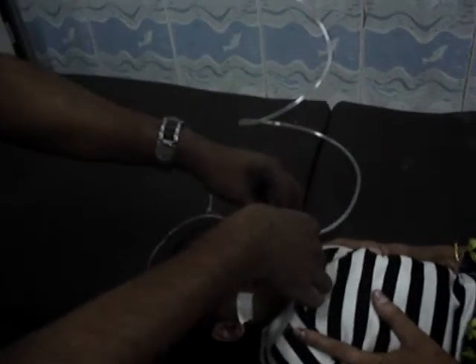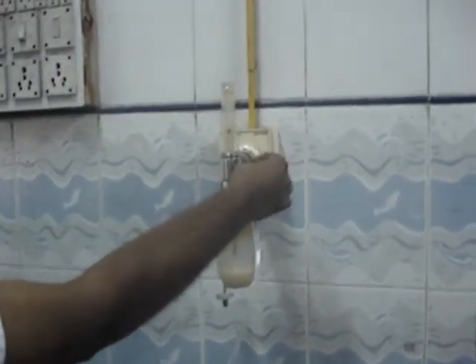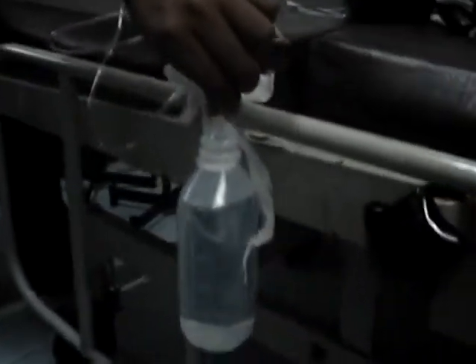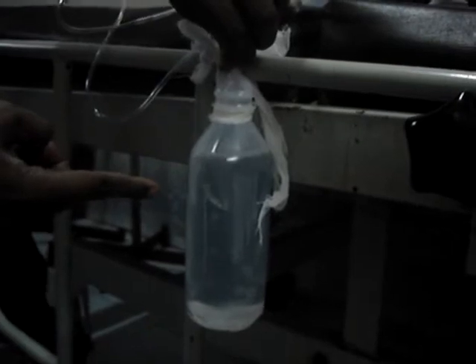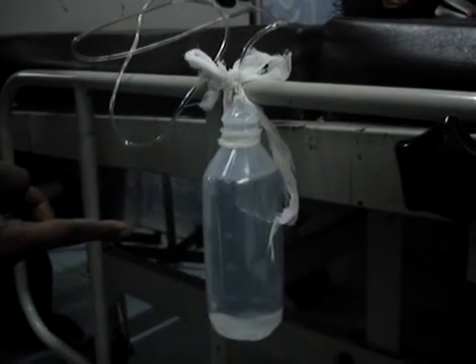We're going to put some sticking tape over here so that the baby is not able to dislodge it. Now, we're going to put two sides up. To keep it in place, it will be better. Now, at this point, you can see that the oxygen is right at the surface. Here, you can see nice bubbles. Can you see the bubbles? These are the bubbles which you can see, and these bubbles are actually doing the work. They're creating the pressure.